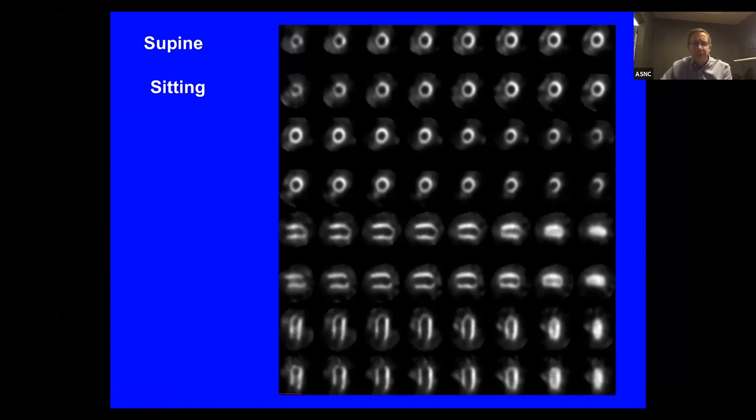So this patient either has an infarct, in which case you do a resting scan to see how much reversibility there is, or there's severe ischemia. Now, in this case, we usually would simply get a resting scan to see how much reversibility there is. There are sometimes, however, where a patient does not have known disease. They've got a roughly normal looking EKG. They've got normal wall motion. They develop chest pain and EKG changes. You see this defect, you say, well, clearly this is ischemic, not scar. We should just cut right to a cardiac cath, or move right along here instead of getting the rest image. Sometimes it is diagnostic just from the stress only images.